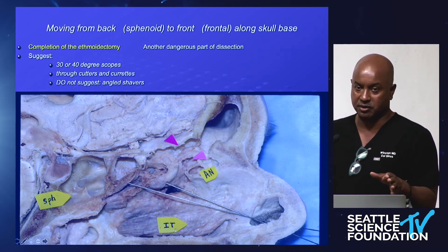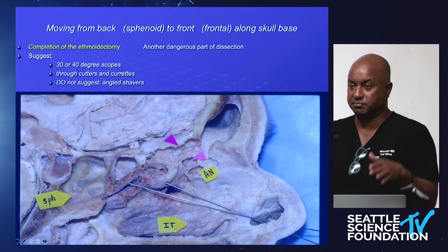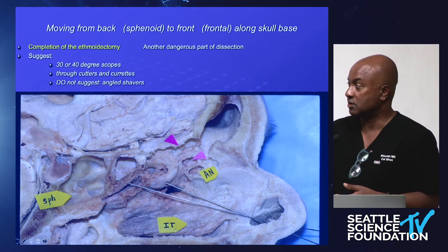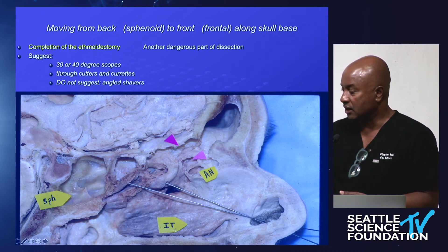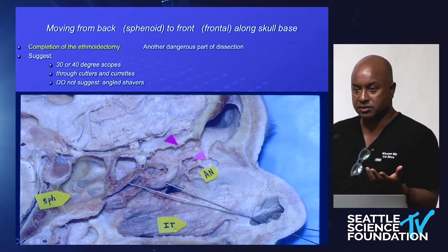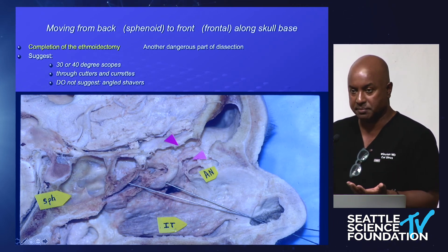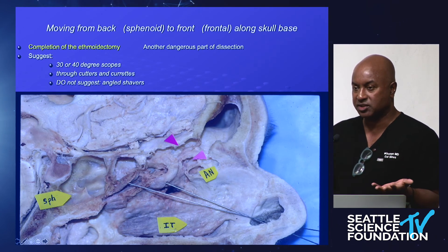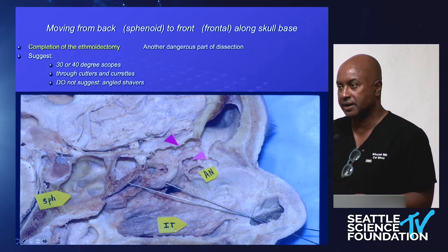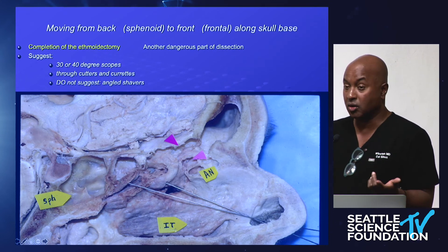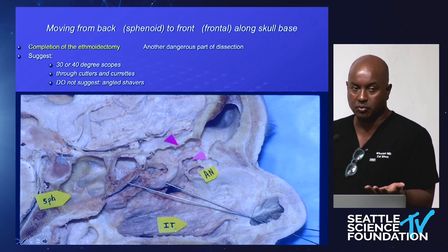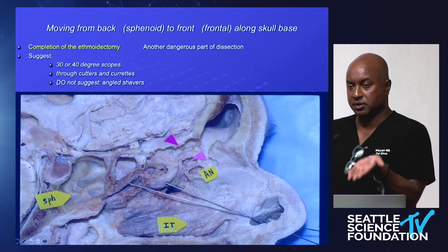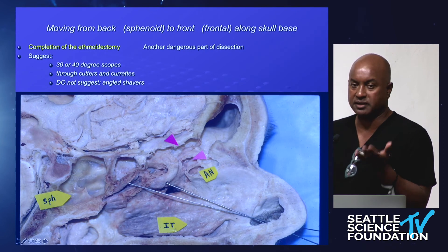Now you've got the medial orbital wall visible, the anterior face of the sphenoid identified, and your posterior-to-anterior dissection field is clean. Complete the dissection of the medial orbital wall if it's still oozing — using a shaver or through-cutting device parallel to the medial orbital wall, not pointing toward it. The posterior-to-anterior dissection involves identifying branches of the posterior ethmoid artery, the shape of the skull base, and the anterior ethmoid artery — all three having associations with the medial orbital wall. Then enter the agger nasi region and begin your frontal recess dissection.